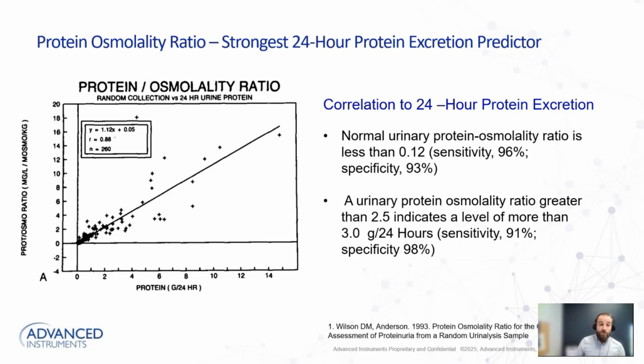So this is also a really helpful tool in making that assessment much quicker, right? Within an hour or two, as opposed to waiting a full 24 hours when you would have to collect all of that patient's urine over the period of an entire day leading up to performing that testing. So it can save you a lot of time and effort.